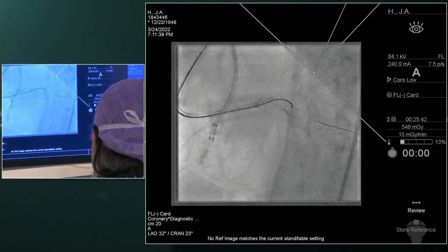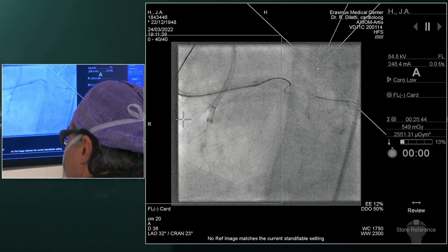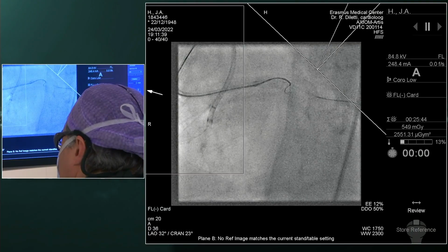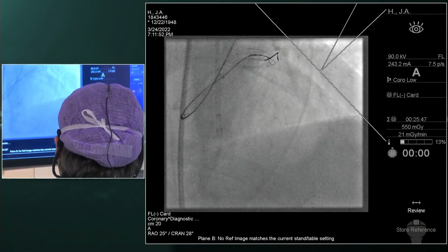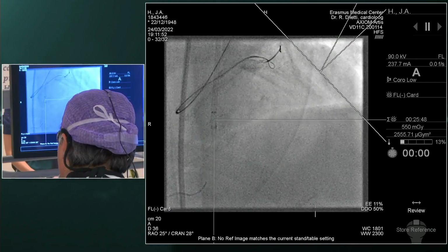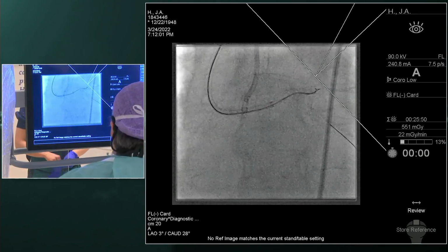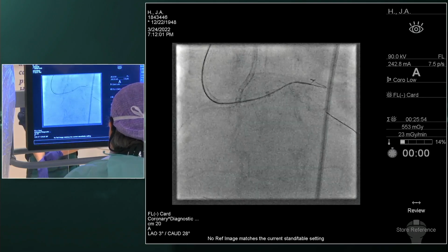It seems in the direction of the LED. The problem here is a bit the support, because you have seen that the guiding is going back a bit.